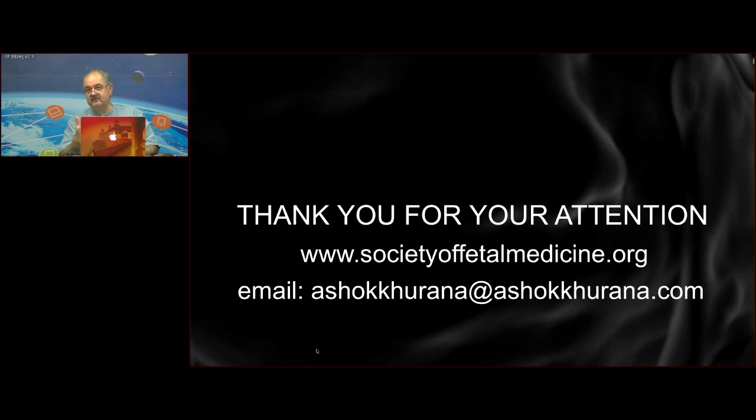And perhaps in the future, we might actually use artificial intelligence to identify how echogenic this kidney is. So I will take an image and send it to an agency that recognizes renal echogenicity, and I have an answer. It tells me echogenic versus not echogenic kidneys. Or it tells me, look, can you please send me another image after switching off harmonics, and I'll tell you whether this is echogenic or not echogenic and how abnormally echogenic it is. And that is the future, artificial intelligence.